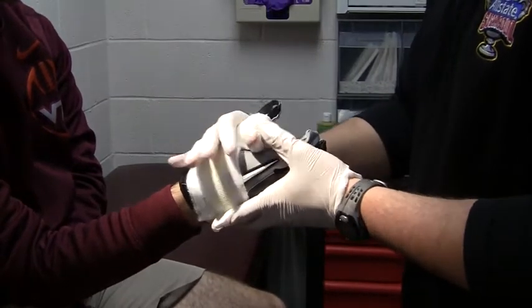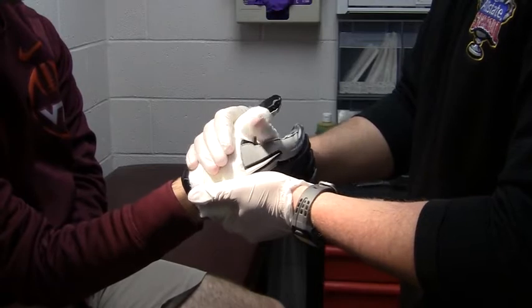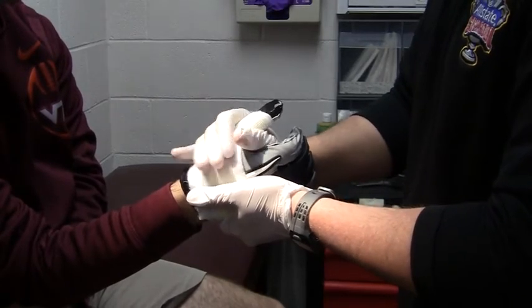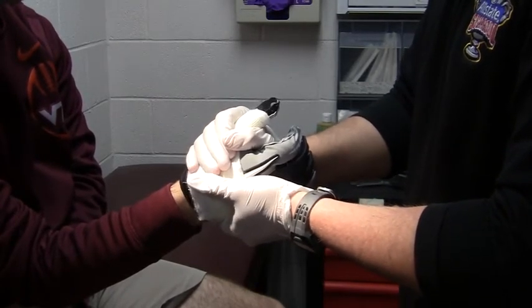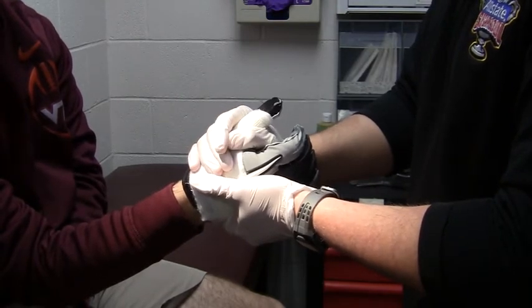Grasp the athlete's hand as shown here, applying a moderate amount of pressure to ensure the casting material is molding to their hand. Once the casting material hardens in roughly 5 minutes, you can use the cast saw to remove the cast from their hand.